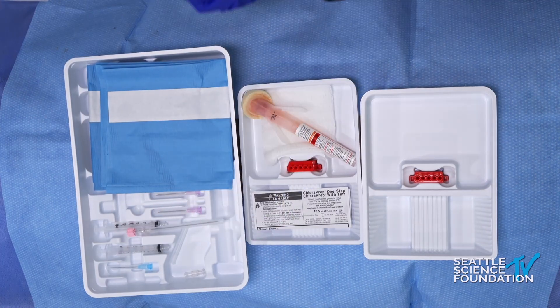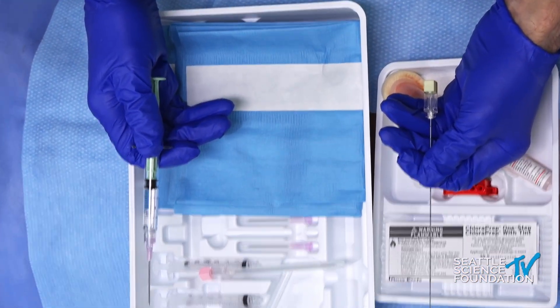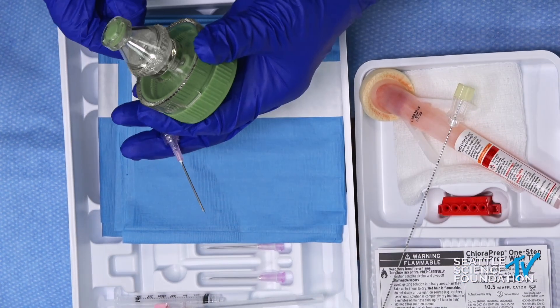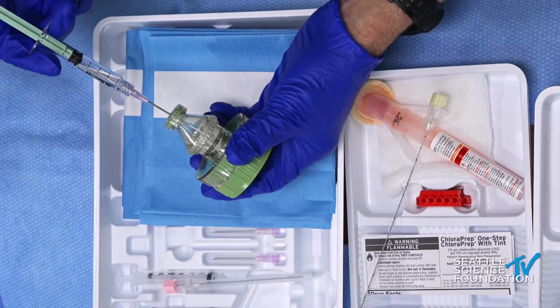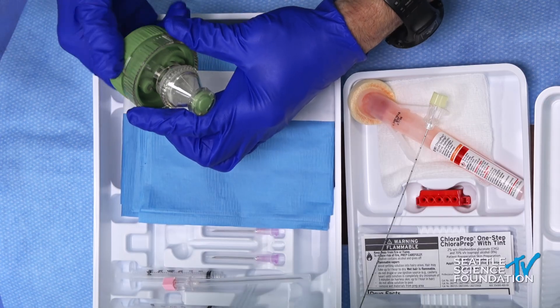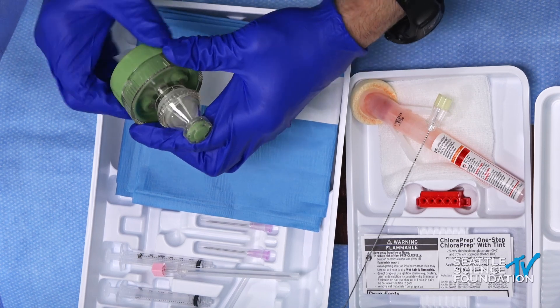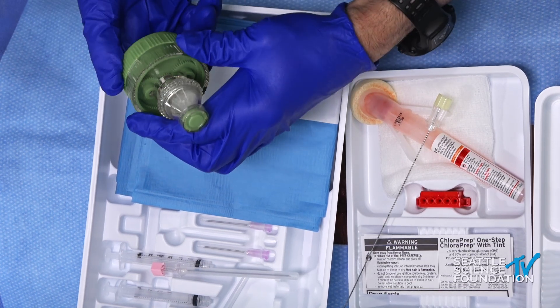Primarily we will be using these two things: an acrylic syringe — I've already drawn up the sterile saline — and we're going to mix the ViaDisc. I'm drawing two cc's of sterile saline and injecting it into this container that contains the micronized disc material. It has a gear accelerator on it, so we just turn and mix this thing for at least 30 seconds.